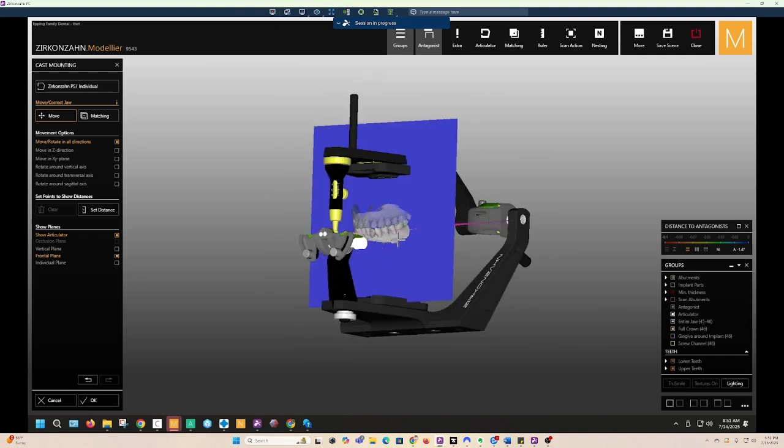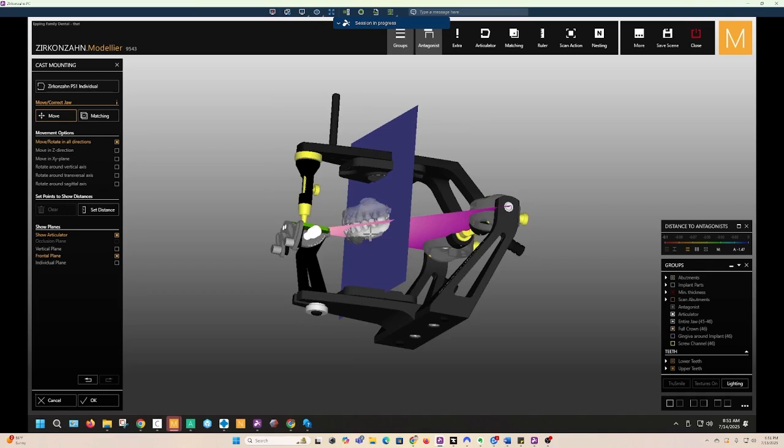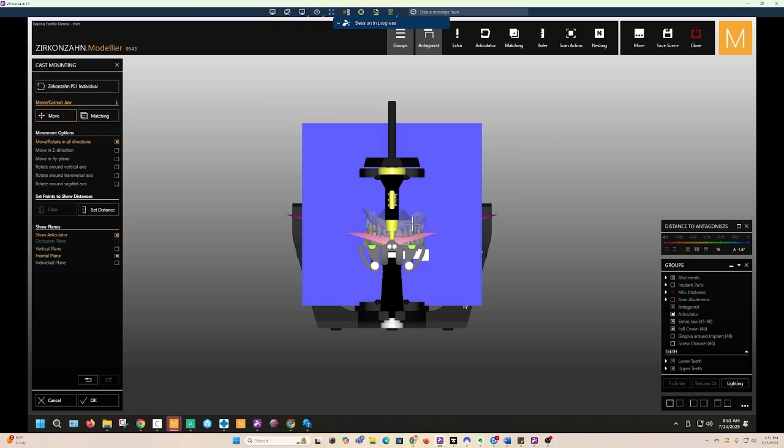Yeah, it's hard. It's actually quite hard. There we go. I would say that's close enough.